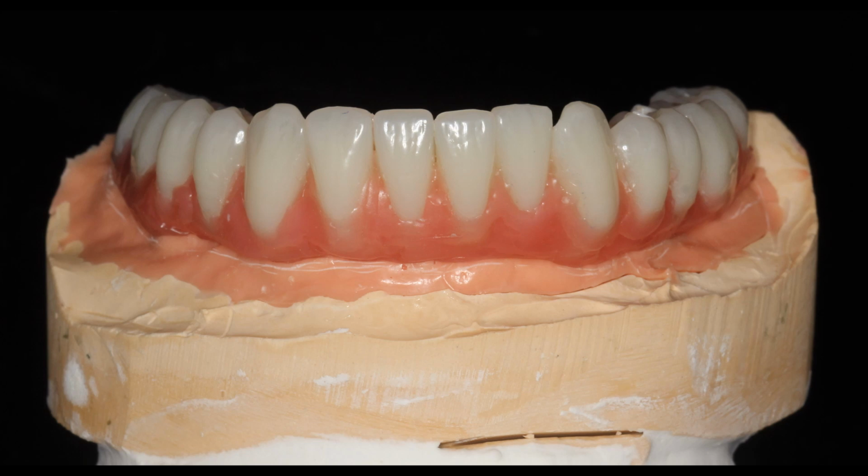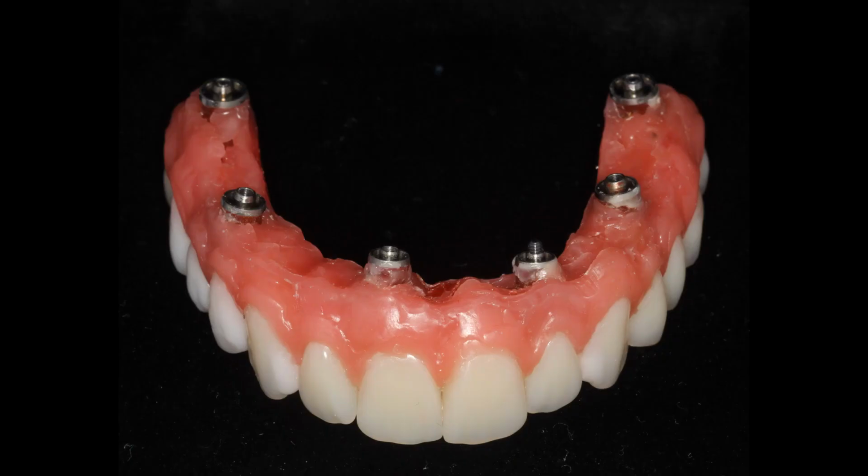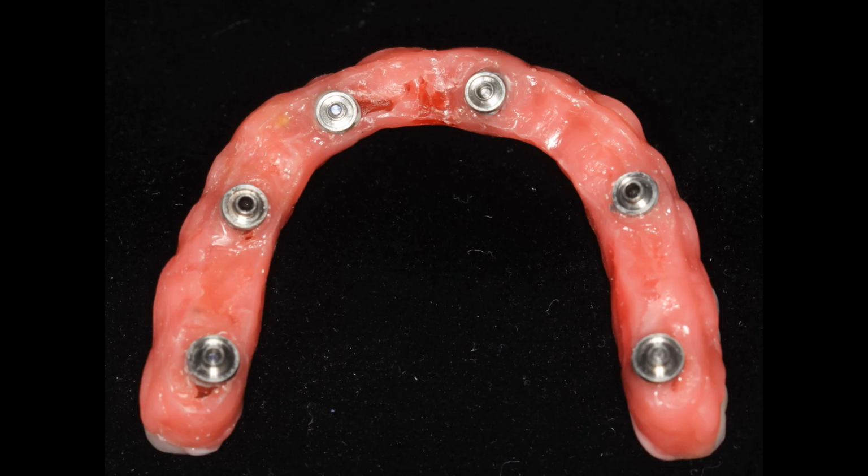Same thing for the lower. It's a little difficult to see, but inside the pink wax is the red impression jig that I showed you a few slides ago. This gives the prototype rigidity and strength so that when we screw it into the implants, it's not relying on the strength or lack thereof of the wax. This is the tissue view of the prototype.